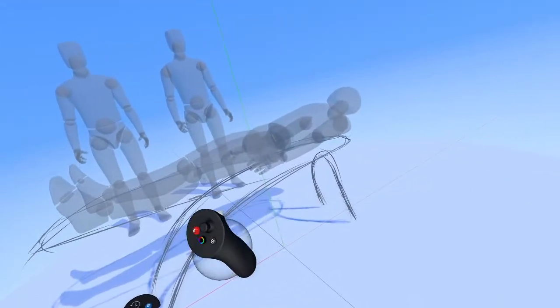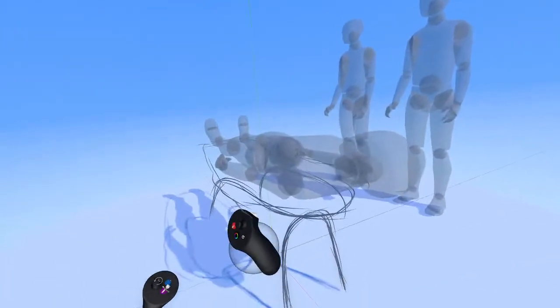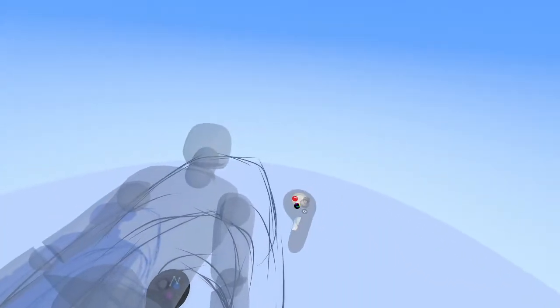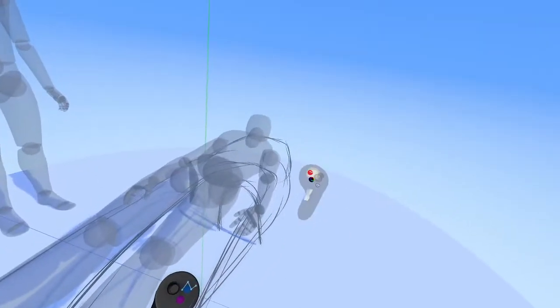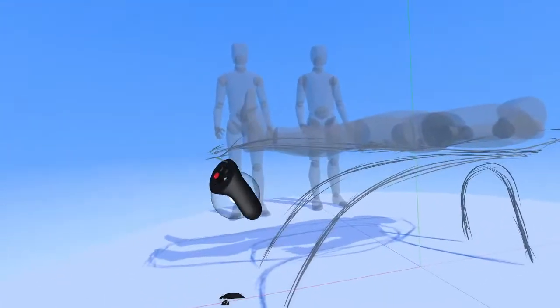And because we're sketching right now, we're not focused on having something super exact. We just want to get the idea down. And so you're going to see me be pretty loose here. And that's okay, because we can actually grab and move these lines around to make sure they're doing what we want. And yeah, this is where we're doing all the thinking. We're not actually building right now, so it's okay to be very loose here.